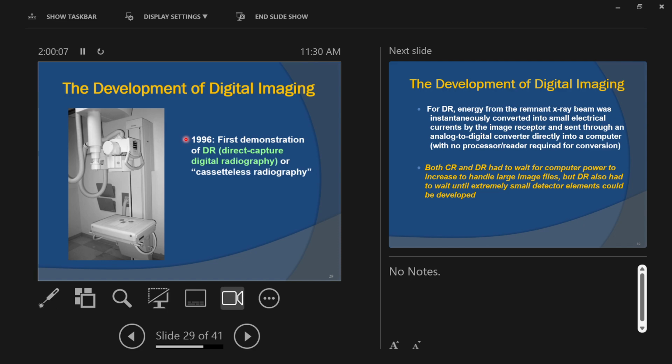I mean, we're talking hundreds of thousands, maybe millions of dollars for the nicest facilities to convert. And if you're a doctor's office, $100,000 or more, that's a lot of money for you, right? So nowadays you can buy these units for like the price of a small car. They've gotten much more cost effective. $25,000 is a lot less of a hit to the wallet than a couple $100,000, right? So nowadays these are much more common. In fact, they're even cheaper and a lot better than a lot of the CR units that you can buy. So these are really now becoming the standard, and it's great.